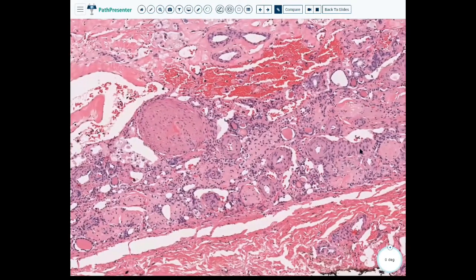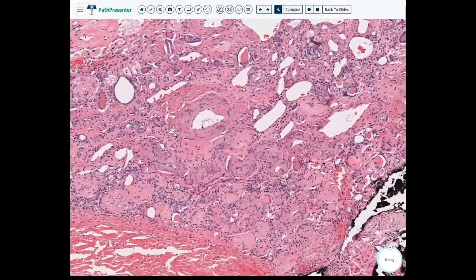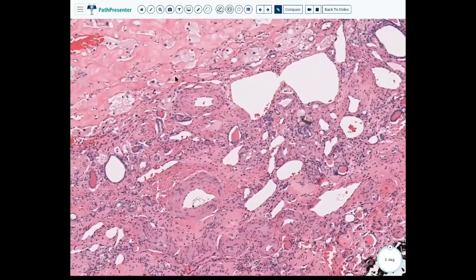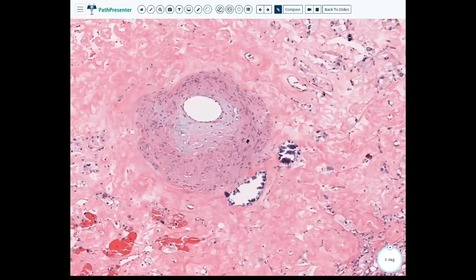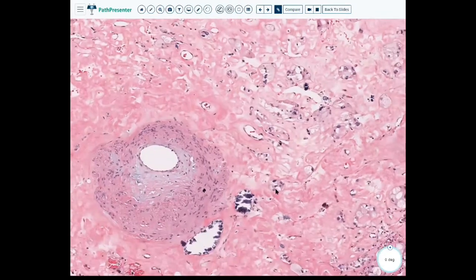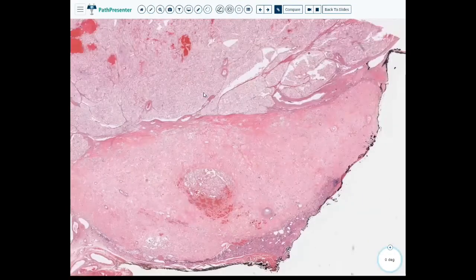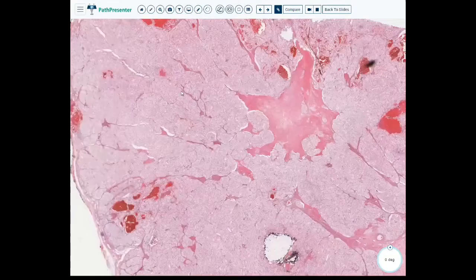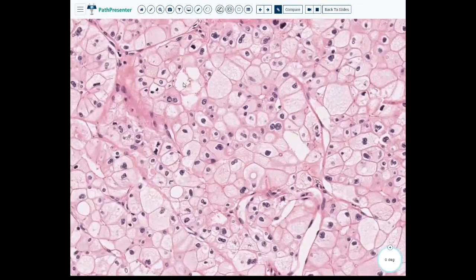Okay. So I think this is a little bit of renal parenchyma, but it's definitely not normal. That's okay. This has been here for a while because we have calcifications. These are not psammoma bodies, they just look like regular calcs. But okay, so hopefully an easier case for everyone to go over. This is just clear cell renal cell carcinoma.